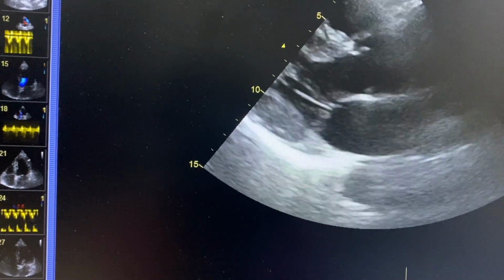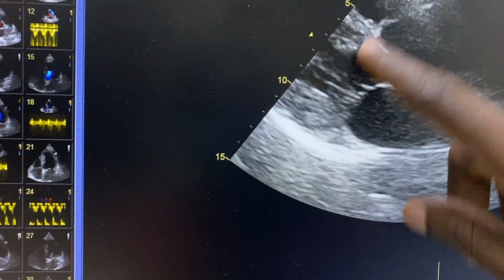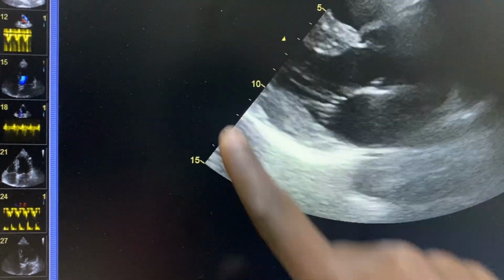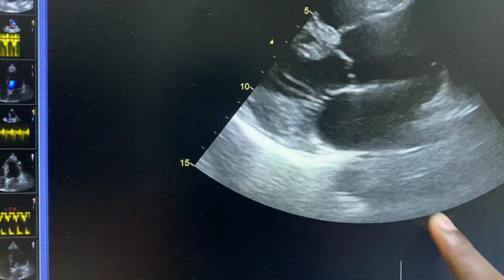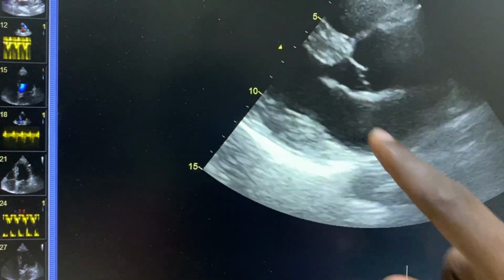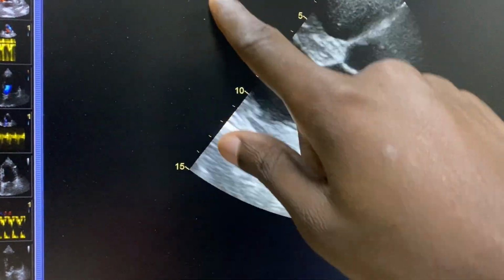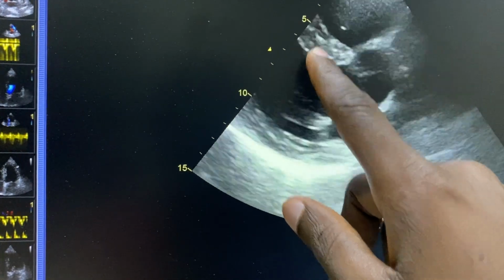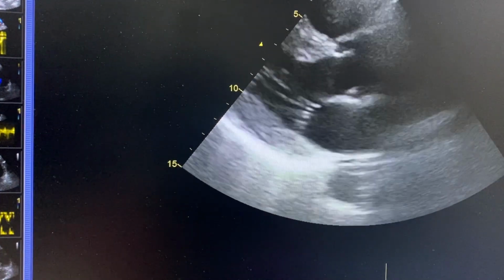The septum is divided into two: anterior septum and inferior septum. So in the PLAX view, we are seeing the anterior septum, and if we are drawing this, we draw a circle there. Remember the other handwritten notes? There was something like this. I named them. So in short axis, the anterior septum is going to be here, and then the inferolateral wall is going to be here. If you draw a line passing through those two, you get the PLAX view. Anterior septum coming first, and then the inferolateral or posterior wall coming next.